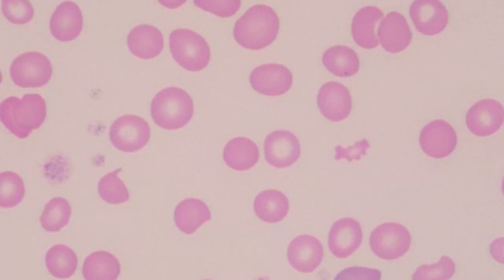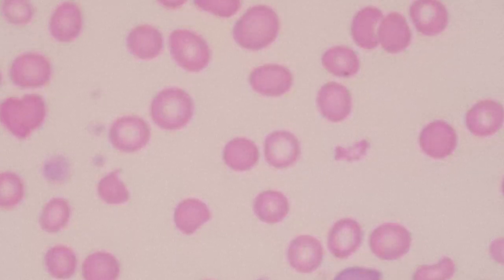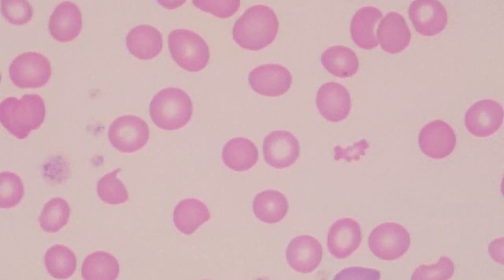So on this particular patient, the patient's MCHC was 30, so that supports the fact that we may see on the peripheral smear some hypochromic red blood cells, meaning that they have an increase in the size of the central pallor.